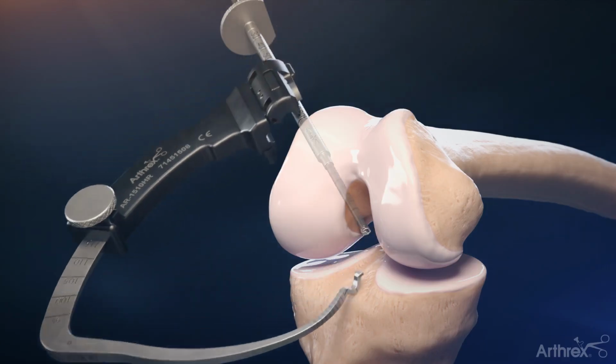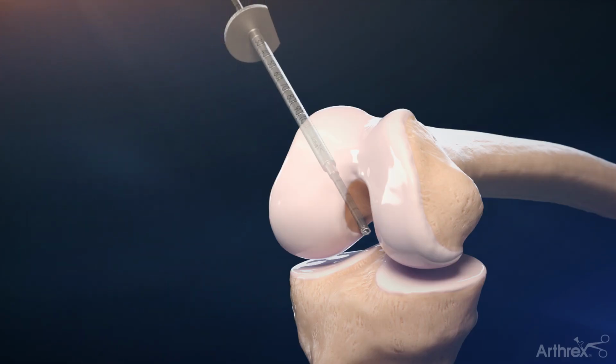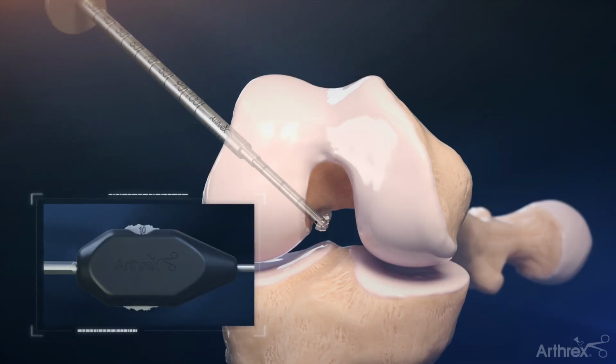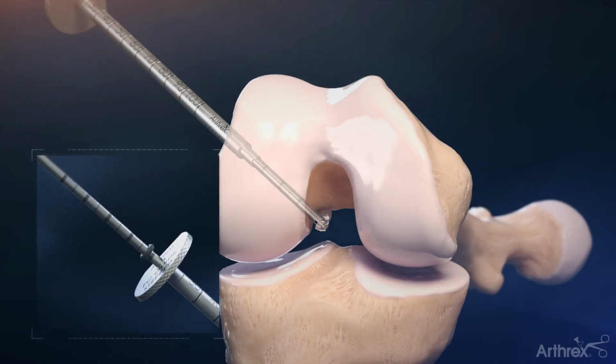Tap the tapered portion of the stepped drill sleeve into the femur 7 mm, or until resistance is felt when reaching the femoral cortex. Using the wheel, deploy the FlipCutter III drill to the appropriate size and retrograde drill back to the sleeve to create a socket.